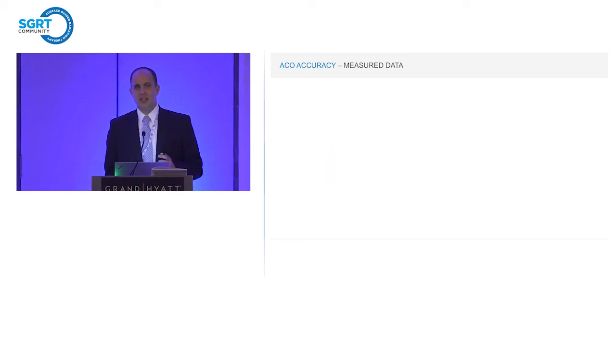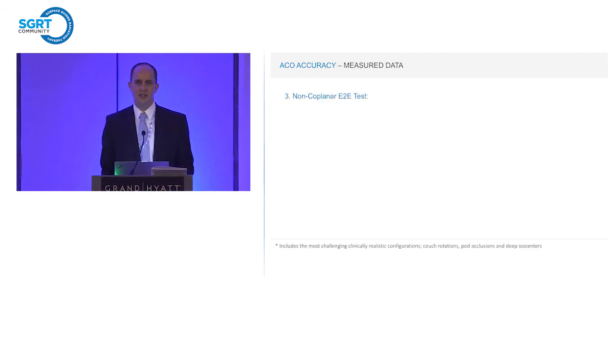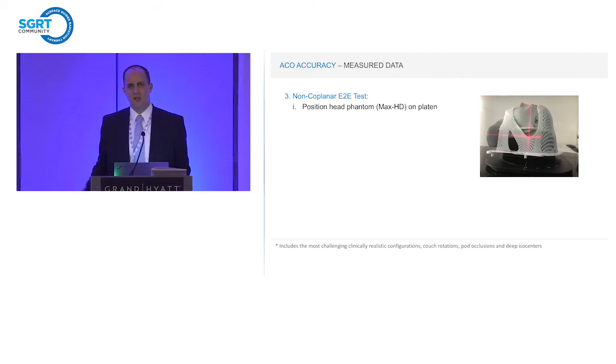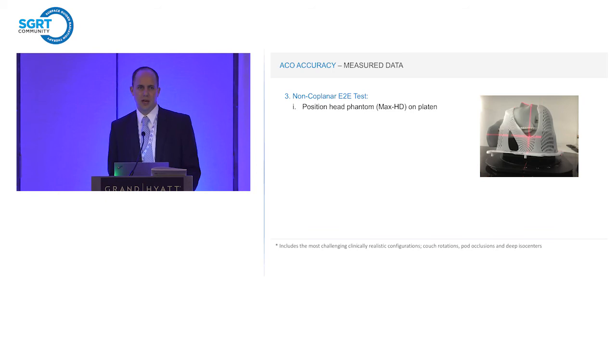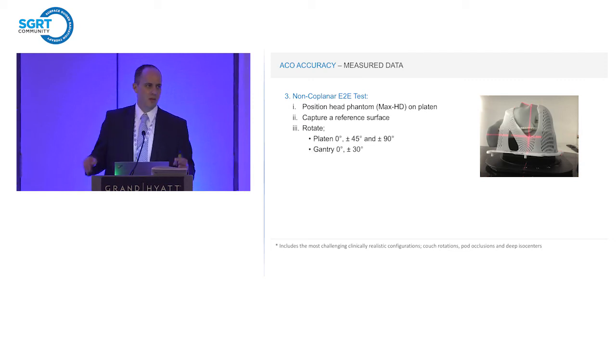The next most challenging test is looking at this non-coplanar, full end-to-end test, mimicking the typical workflows, the typical configurations you'll see during SRS treatments. The idea here is, again, we use our rotating platform so that we can eliminate any potential couch walkout as a variable. So at the 0 position, we capture a reference surface of our Max HD phantom. We then go through a variety of different setups. We rotate the platen plus or minus 45 degrees, plus or minus 90 degrees to mimic couch rotation.